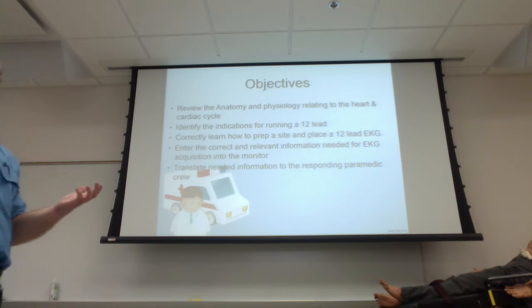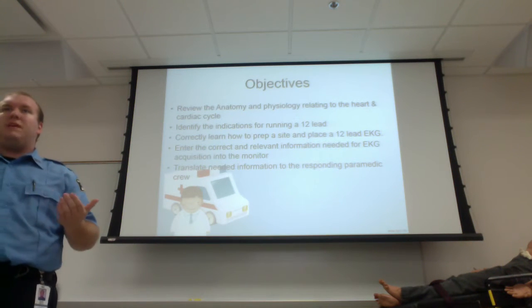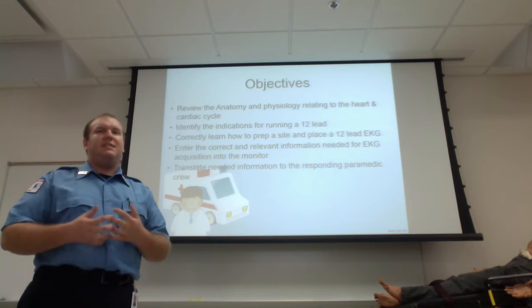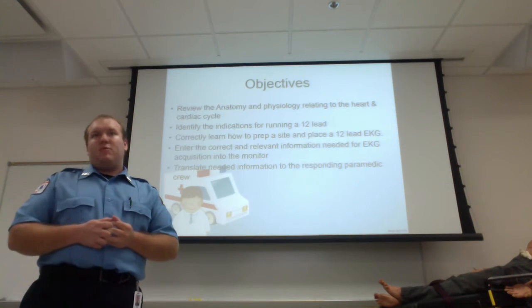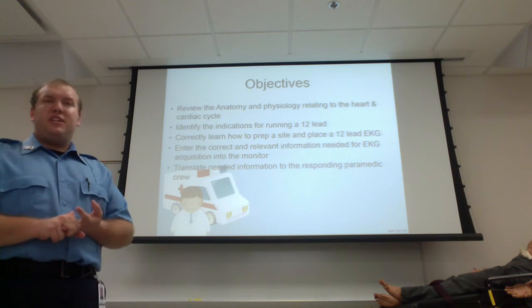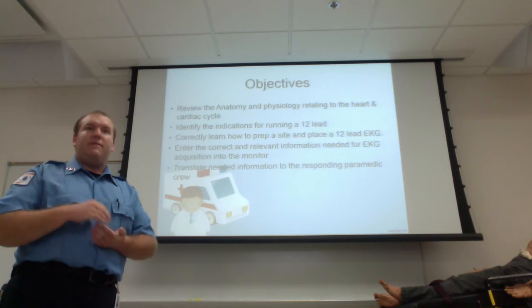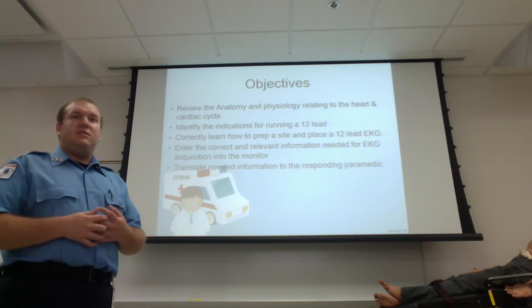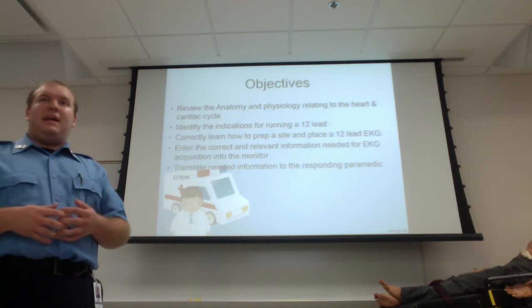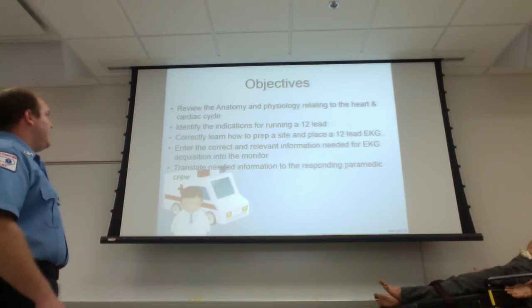What information is going to be needed for that 12 lead? Obviously, for most patients, you don't have to put in their entire name, their birthday, everything else. However, their age and their gender are two very important things. A lot of our monitors are programmed so that as soon as you hit that 12 lead button, it'll ask for their age and then their gender, and that's it. Then it automatically starts acquiring the 12 leads. So that's one thing we're going to look at.